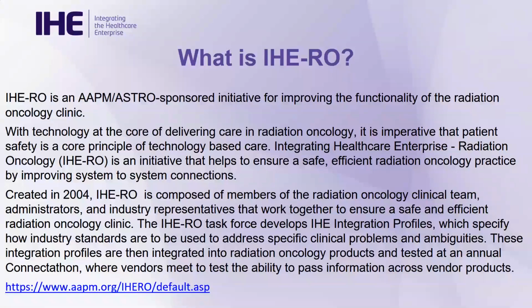So there's no ambiguity or misinterpretation. IHE-RO goes back to 2004, so it's been around a while, and we have people that are members of the clinical oncology team, physicists, and industry representatives, and everyone works together to try to make sure that we get the details right to solve real-world problems. The task force, or actually it's a technical committee, works with the planning committee and develops the integration profiles, and we'll get into that in a little bit.